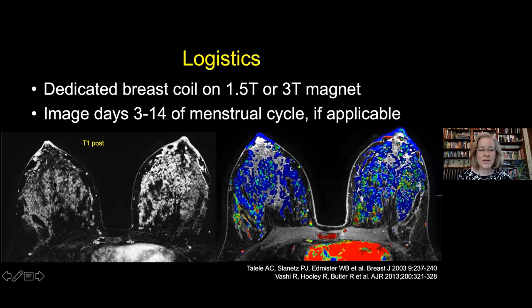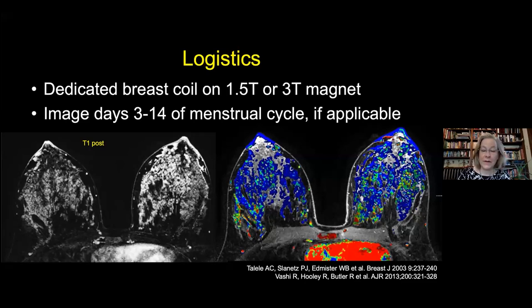Here's a good example: this patient has a lot of marked background enhancement. This is our kinetic map—a color-coded map that puts blue on less worrisome areas and red on areas that might be more worrisome, though red is also seen in the heart. This patient couldn't be controlled for her menstrual cycle because she's currently lactating. Lactational changes are challenging with breast MRI and will make it more difficult to evaluate a patient with a new cancer diagnosis; the sensitivity may be somewhat lower.